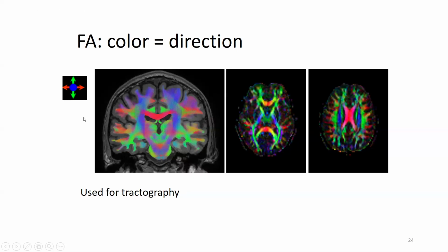And then I also have here the blue one. In the axial slice, it's shown as going into the image. So then we go again to this, what I call the, do I have my mouse? Yeah, this is the posterior limb of the internal capsule, but I can also see it here. Where's my motor cortex?